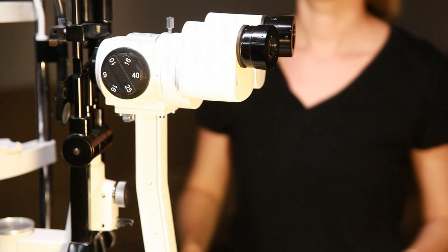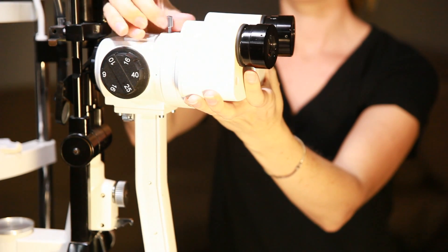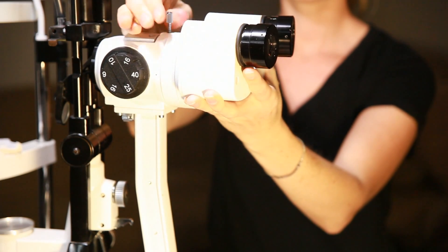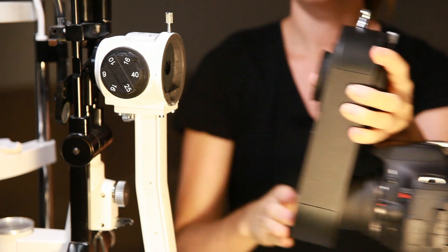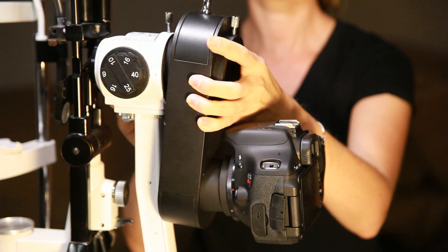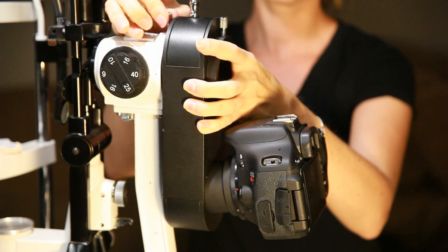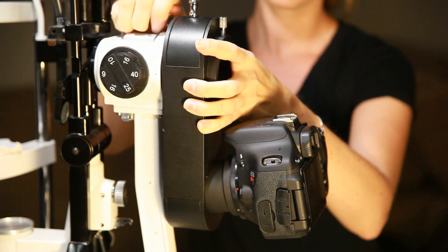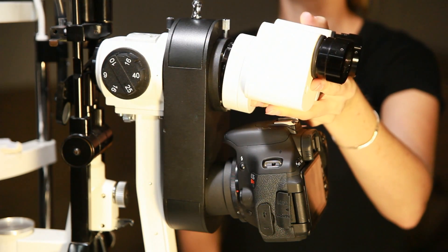We start by removing the slit lamp oculars. Next, we attach the iMacam SLR adapter to the slit lamp. Then reattach the oculars.